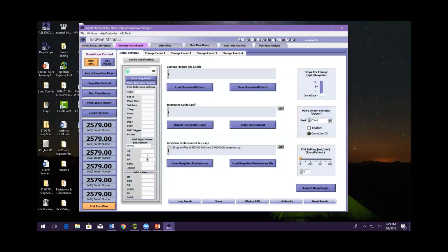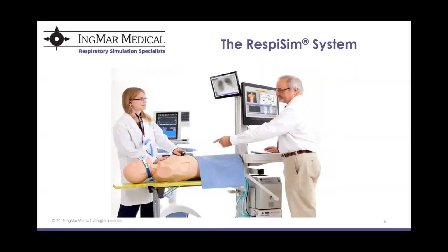Oh, so I have a question back about non-invasive. It says, explain putting on the mask for non-invasive. Where would it go? Brian's going to show a picture of our system with the mannequin in it. This is the Pro package.